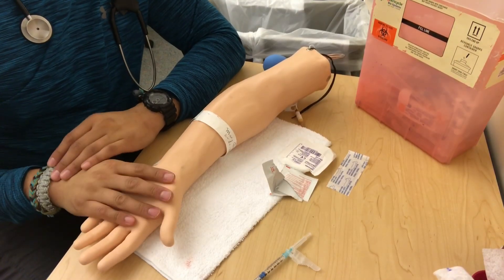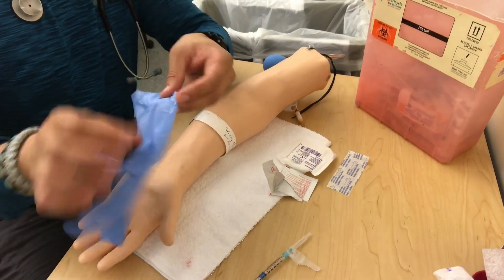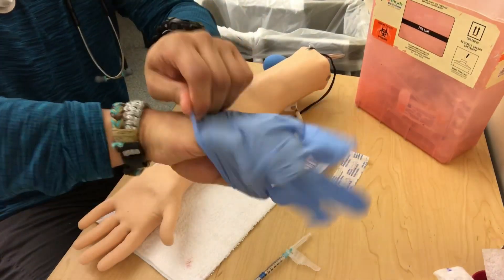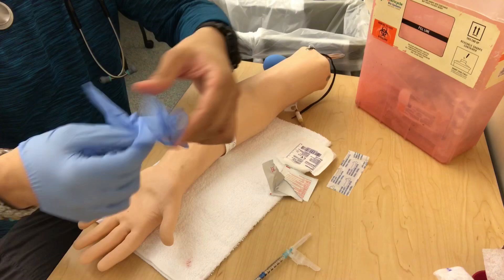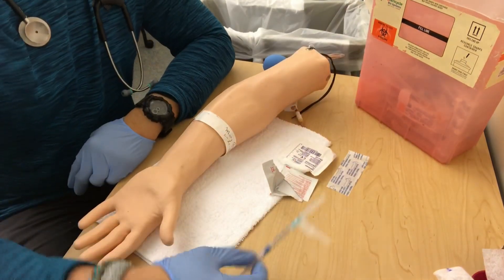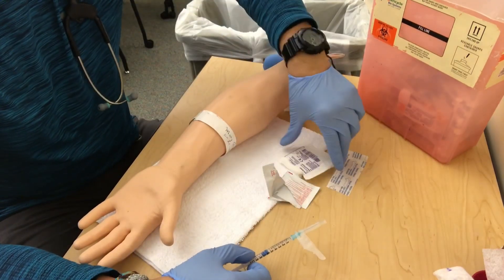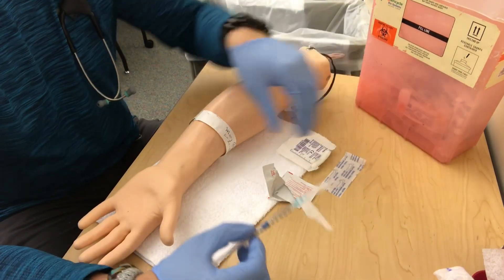We have our ABG arm, we have all of our equipment that we need, and we have our gloves of course. So we have our heparinized syringe with our 23 gauge needle. We have alcohol prep, we have our 2x2 gauze, and we have our band-aid ready to go.